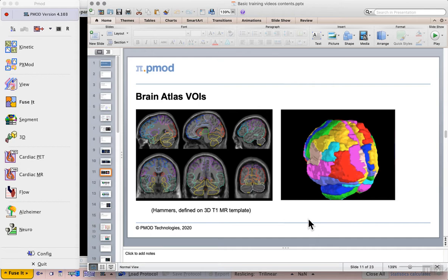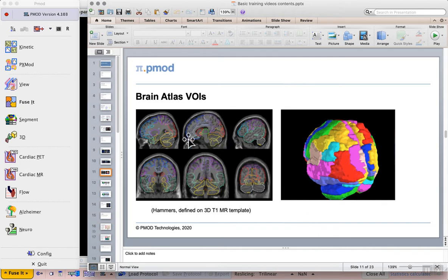In PMOD we provide several templates for the human brain and also for various animal species. These were mostly derived by users in the imaging community and then made available to us or to everybody via online resources. The atlases correspond to an underlying template and in some cases we have not only MR templates but also various PET and SPECT templates available.